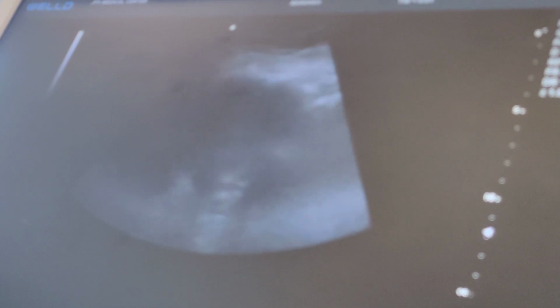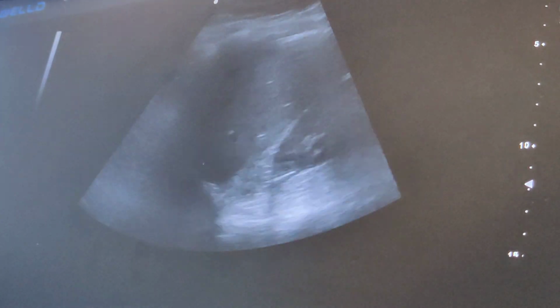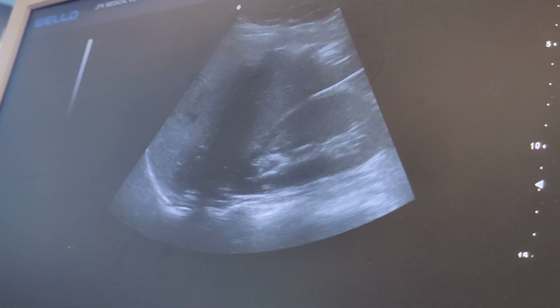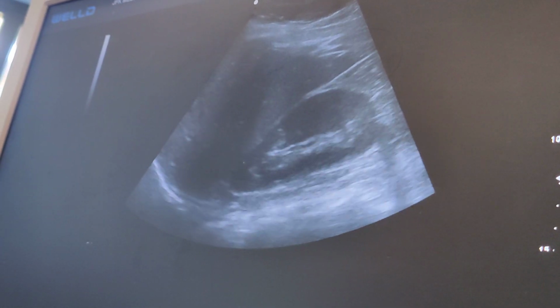Deep breath in, and again, we're just sweeping through. Make sure we see all of the anatomy. You also want to be sure you come up and get your superior portion of the liver. Make sure you're not missing anything. I like to see the dome of the liver in transverse. We'll get a view of that in just a couple minutes.